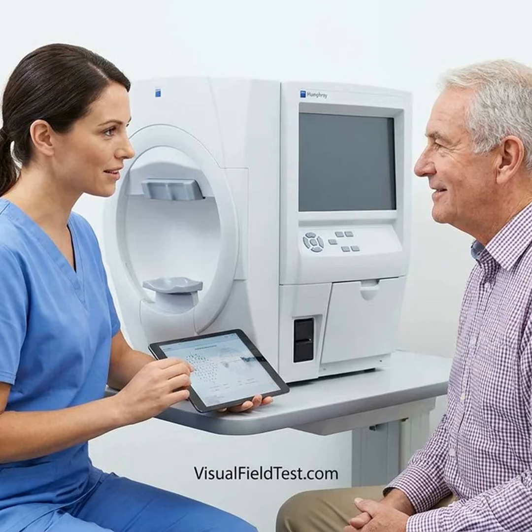Why patient education matters. A patient does not need to see every light to perform well. The goal is to respond accurately to the lights that are visible and to avoid pressing the button simply because a light is expected. Education helps patients understand that the lights vary in brightness. Some lights will be too dim to see. Missing occasional lights is expected. The patient should look at the central fixation target rather than chase peripheral lights.